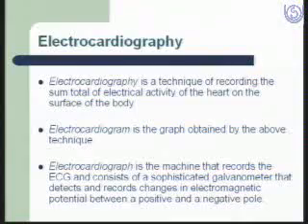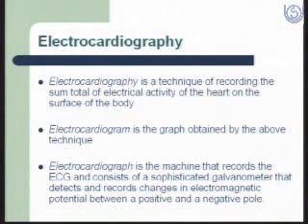So today we will be covering electrocardiography from basics to clinical practice. The first slide: what's the definition? Let's define a few terms first. Electrocardiography is a technique of recording the sum total of electrical activity of the heart on the surface of the body. Whereas electrocardiogram is the graph obtained by the above technique, which is commonly known as the ECG, and the machine which records this ECG is known as the electrocardiograph.